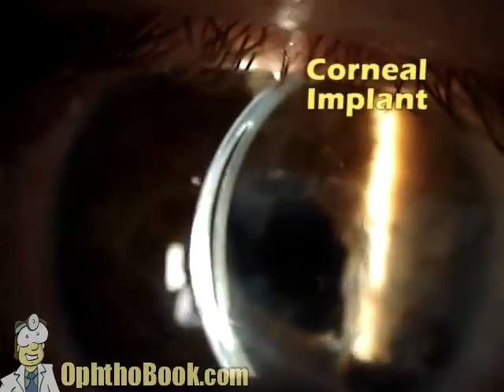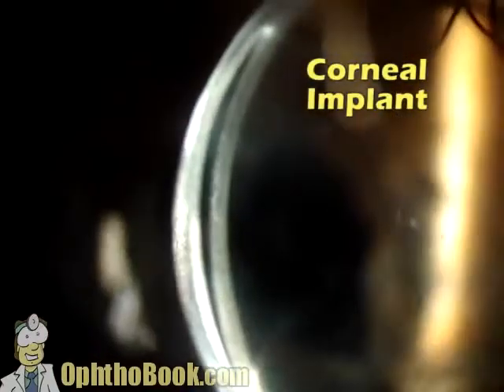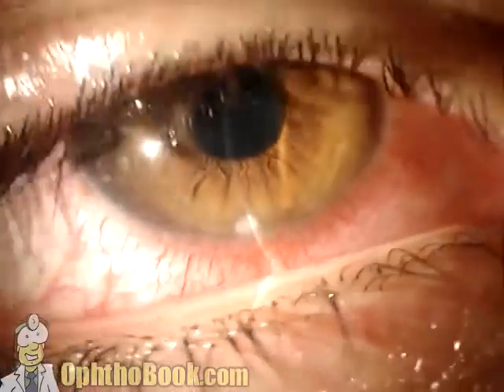This is an experimental lens done about 15 years ago. It was put inside the cornea itself. And when we do our cross-section, you can see that dark gap right in the middle of the cornea. A very elegant way of looking at the cross-section. Very nice.